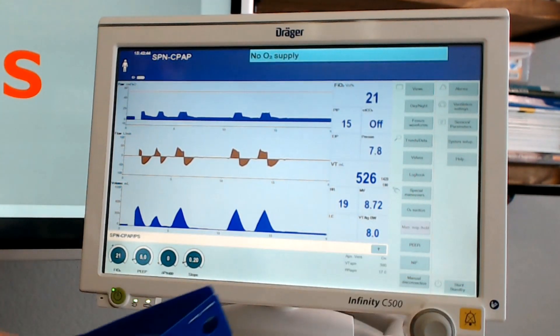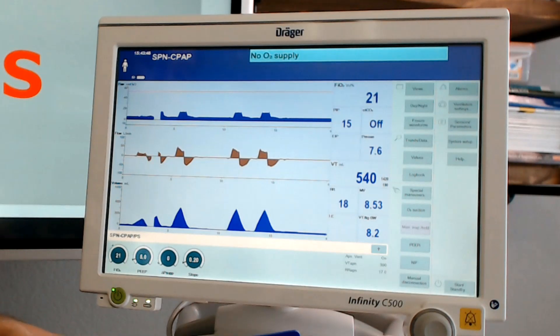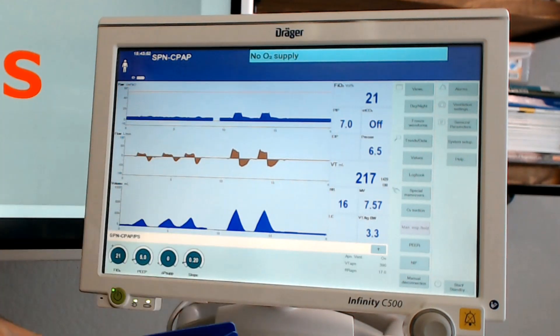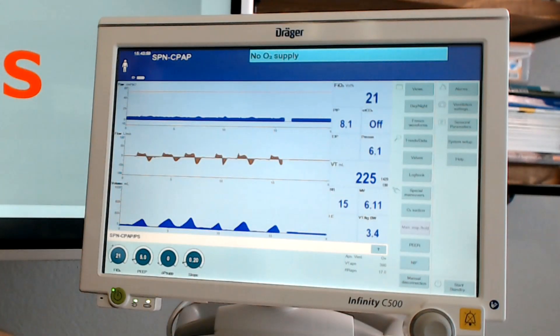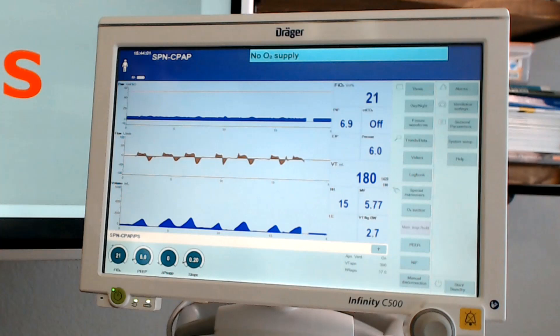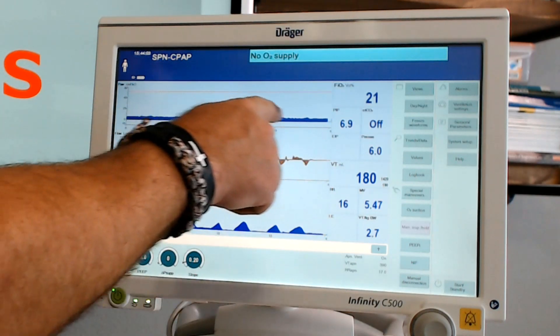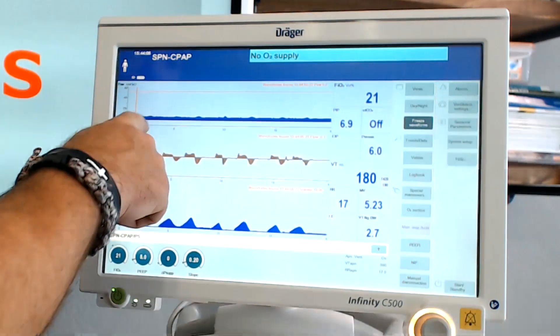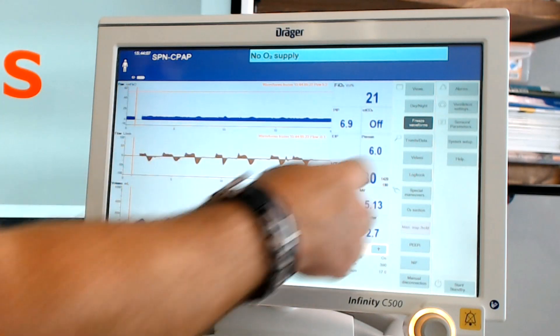I'm going to take it back to zero. I want to point out one more thing here before I let you go. We see flow happening. We see tidal volumes happening. Pressure support is zero. Tidal volumes are very small, 170, 225. Look at the pressure volume waveform. Nothing. Nothing happening above baseline.